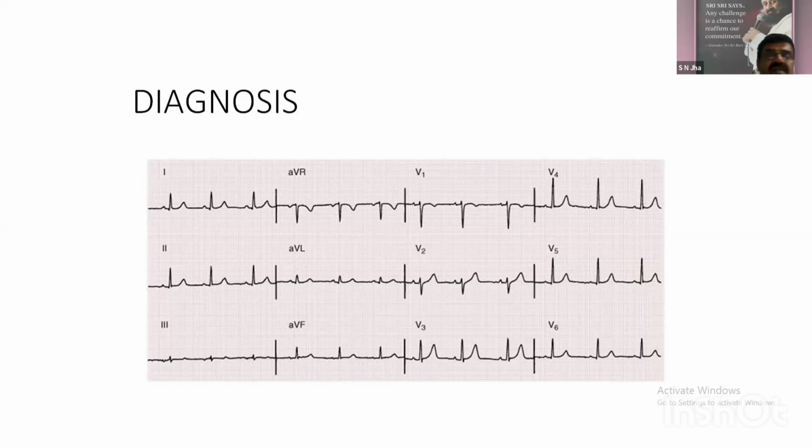If you see, this is called sinus rhythm. If the interval between these two is not the same, the most common arrhythmia we find in ECG is atrial fibrillation. We say that if the RR interval varies, as in atrial fibrillation, it is not a sinus rhythm. So we call it whether the ECG is in sinus rhythm, the normal rhythm of the heart, or not. And then we can find out the rate also.